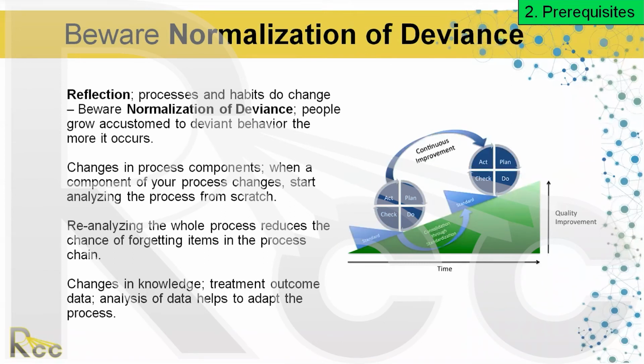So going back to the process management, and it's a continuous thing. I mentioned before about complacency. Beware of complacency. And there's also a concept called normalization of deviance. It's a big thing, but what it means is it's like a slippery slope. You let one thing go, and then that thing becomes normal, and then you start skipping that process step, and maybe you let another thing go, and that can really come back and bite you.